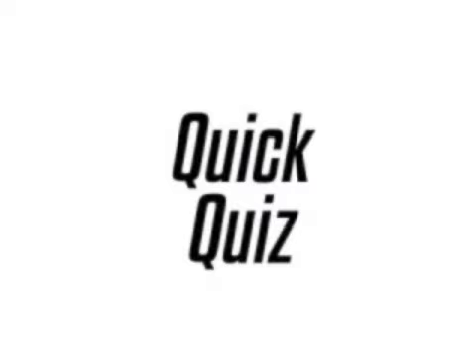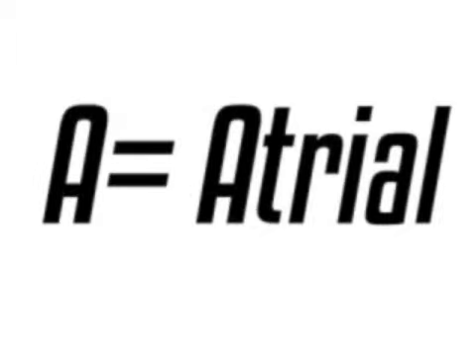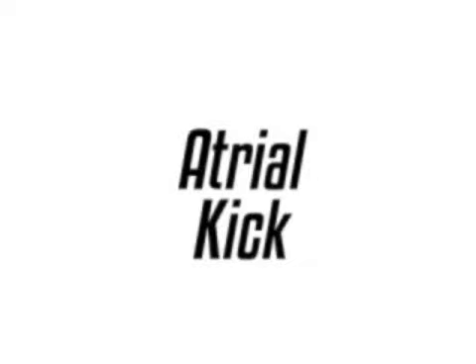Okay, quick quiz. If you don't understand these concepts and answer these questions correctly, then you are not allowed to go on. You have to go back, listen again. So, first up, what does the E and the A stand for, and what do those waves represent? So, E stands for early, right? What does the A stand for? Atrial. And so, therefore, what do the waves represent? Well, the E wave represents early diastolic filling, and the A represents the atrial kick, that part of diastolic filling. So what is normal? Normally you get more filling in the early stage, so E greater than A.